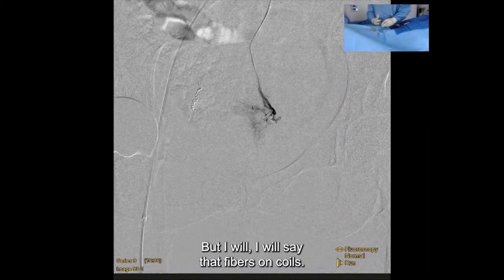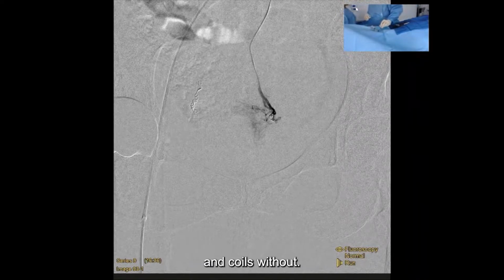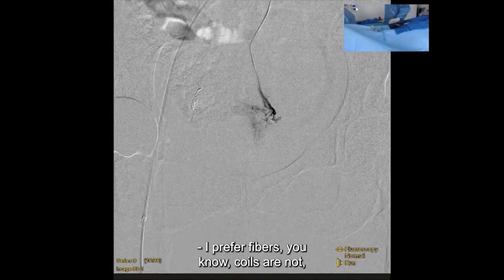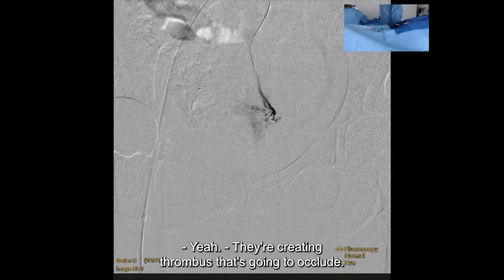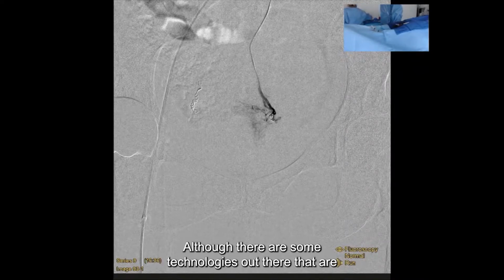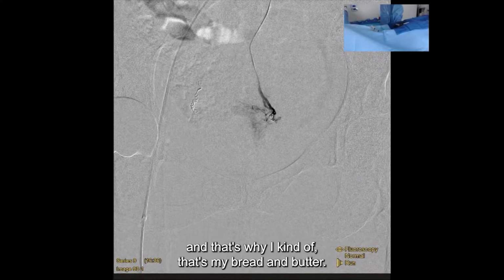I will say that I prefer fibered coils. Why don't you give me your thoughts on coils with and without fibers? I prefer fibers. Coils are not, for the most part, mechanically occluding. They're creating thrombus that's going to occlude. Although there are some technologies out there that are trying other things, my greatest experience is with fibered coils, and that's my bread and butter.